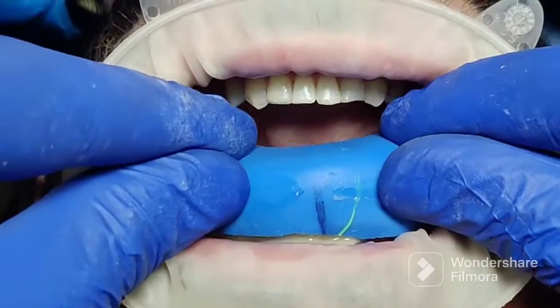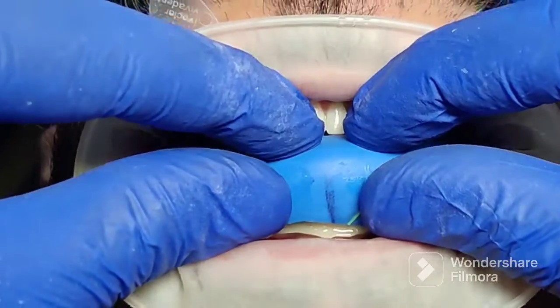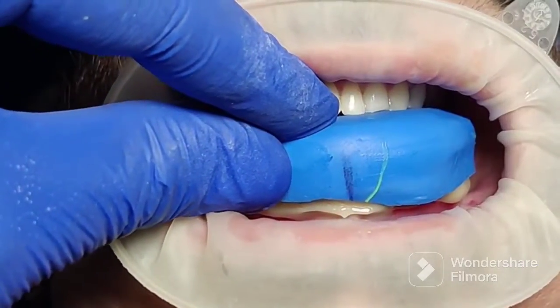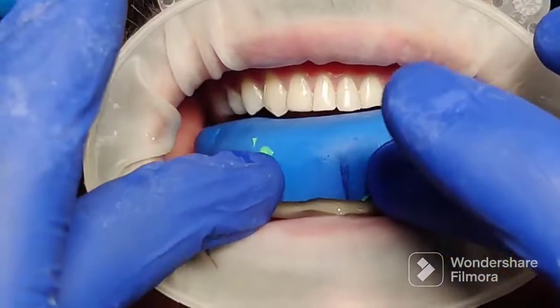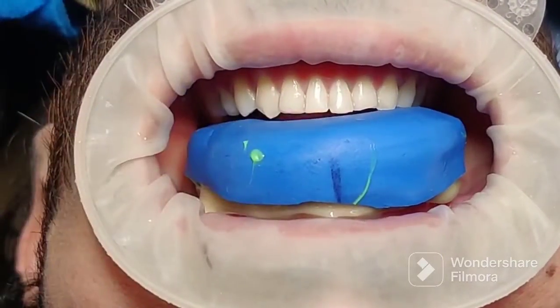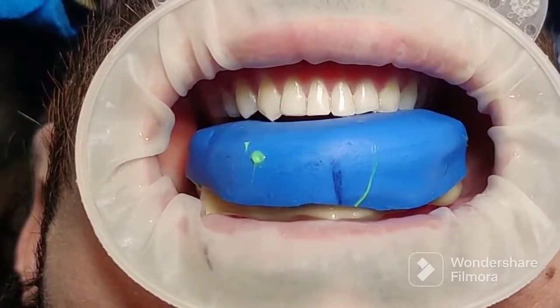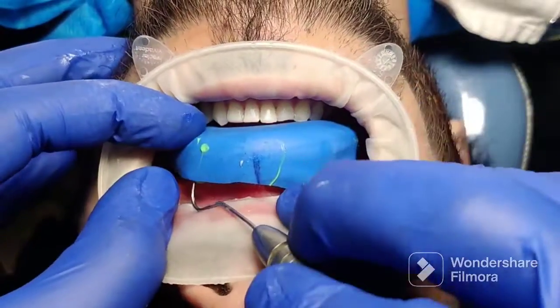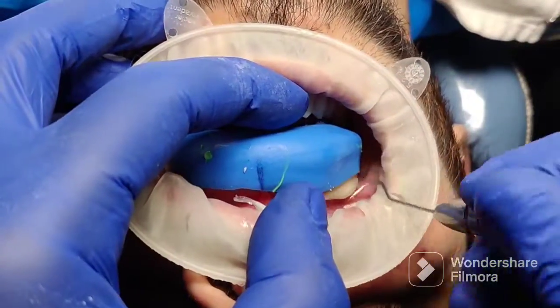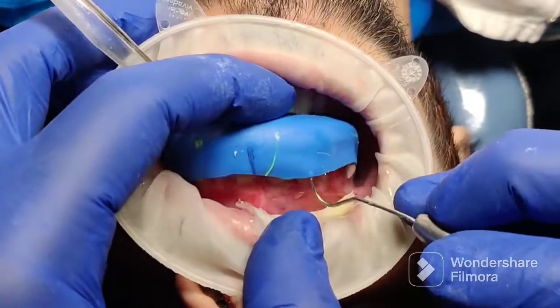You're also going to squeeze on the buccal aspect to remove any excess and to get a very nice marginal fit. Once the material has set, very importantly, peel out the putty index — do not push it out, because if you do that you might dislodge the veneers from the tooth surface.